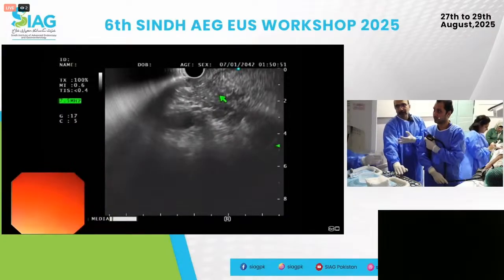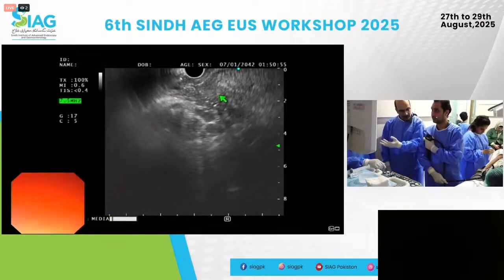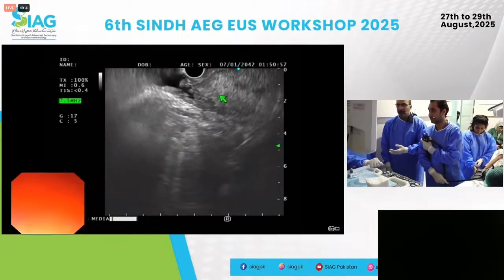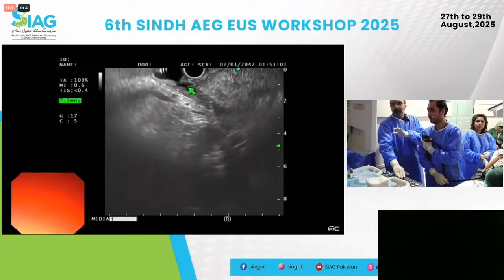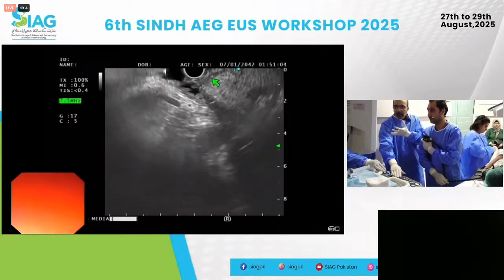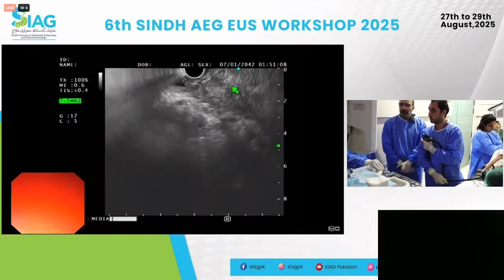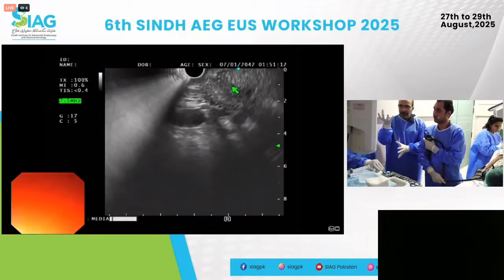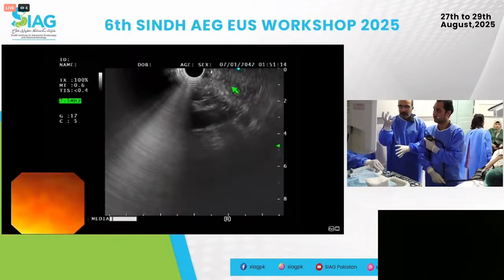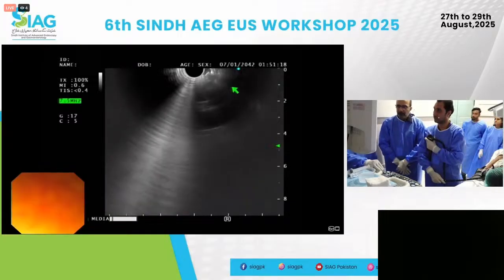Okay, now clockwise. Don't do too much big wheel, okay? Go clockwise. Okay, good. That's your duodenum. So that's how far we were. Now relax. Now go counterclockwise. If you want the uncinate, you need to go counter, right? Again, you have tension on it. I can tell just by the appearance. So relax that big wheel. Too much big wheel is a problem. Pull back the scope. Pull it back.